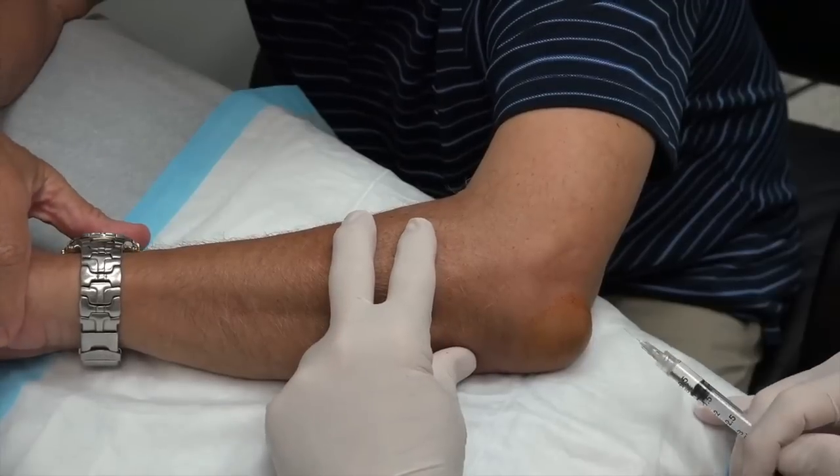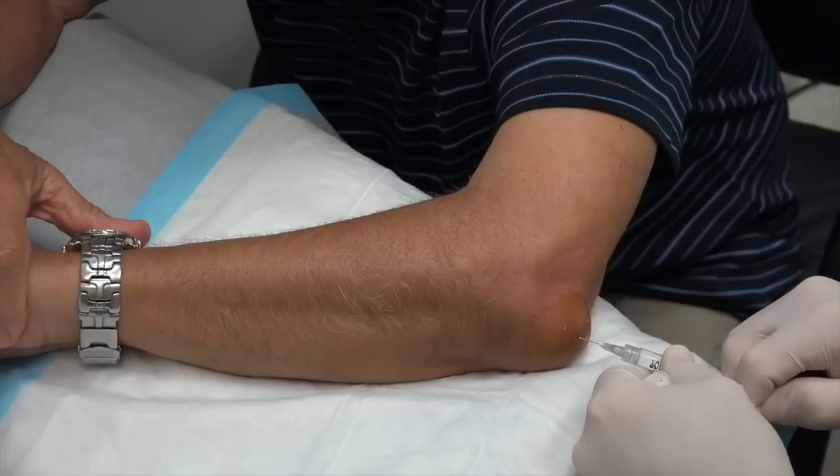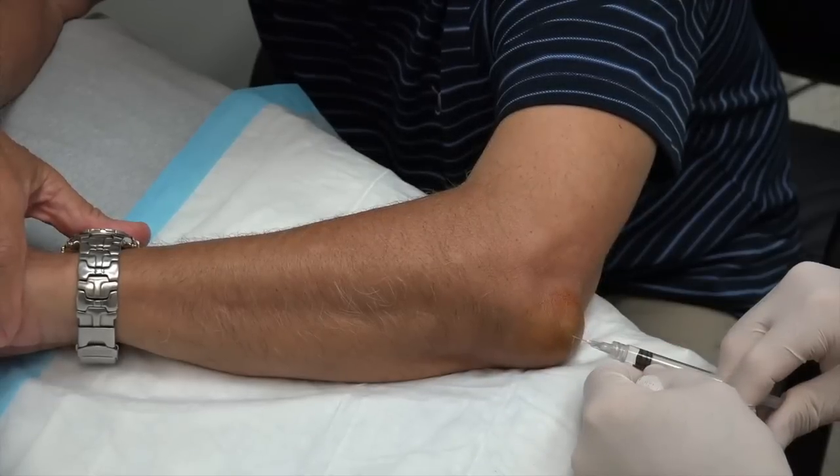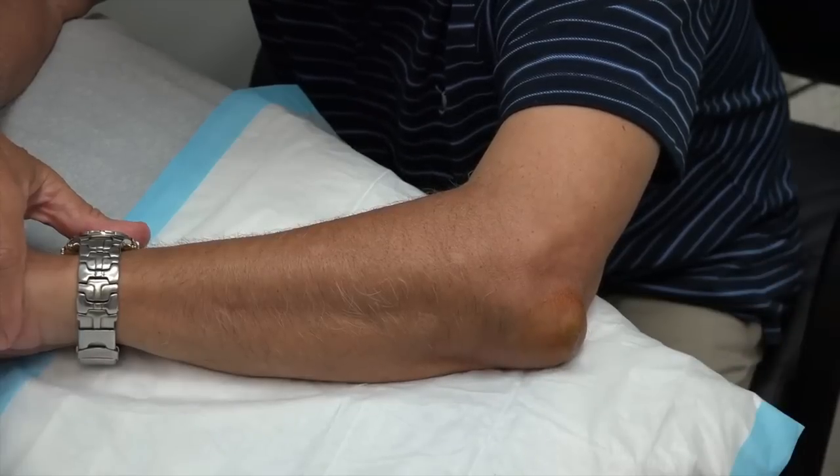Gumby Jean is going to spray a little cold spray on your elbow and then we're going to numb this up for you. There you go — a little stick, a little bee sting. Did you feel that? And that's just some 1% lidocaine? Correct.